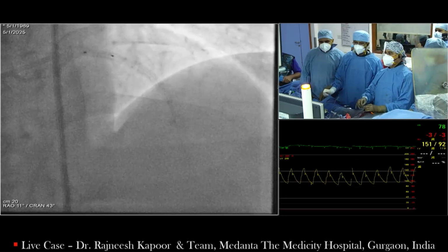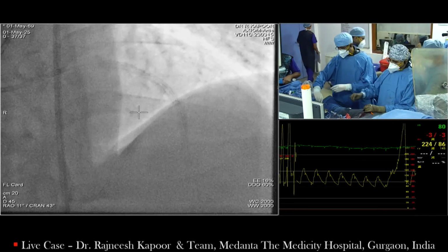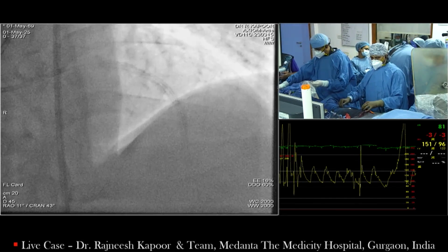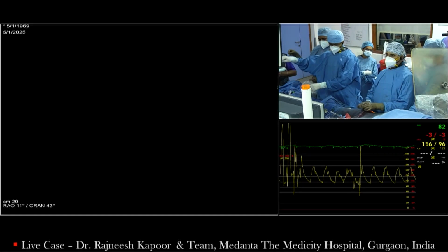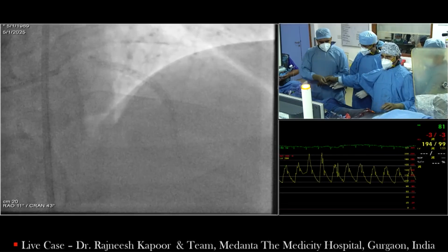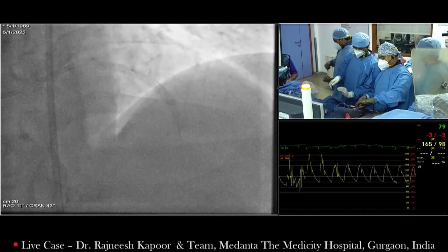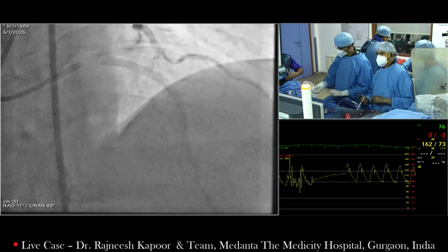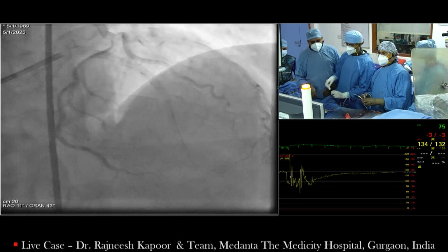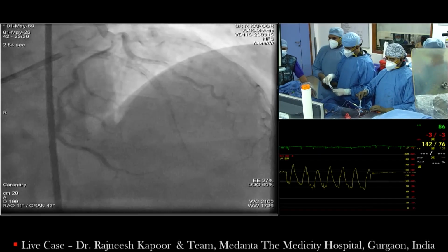Okay, 2.75. Any other comments from our panelists? And then I think we have to close. Okay. I think these were both great cases. I think they help us think about complex calcified lesions from the standpoint of taking time out to really think about your strategy and have a planned progression of how you're going to move, and also the importance of imaging to help you define the complexity of the lesion. Even though it may appear to be slightly calcified, it may be more calcified than you appear, or if it's heavily calcified, again, just to help you get with your strategies.